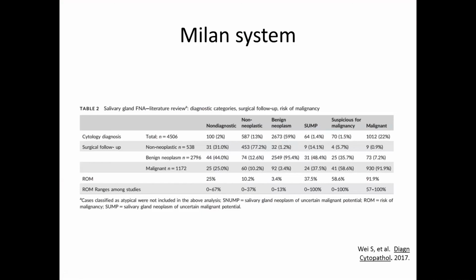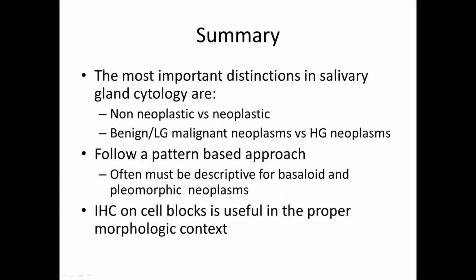So interesting to see how the risks of malignancies sort of shook out in all of those diagnostic categories, and also interesting to see how they divided up the neoplasm category. So I'll kind of end there.